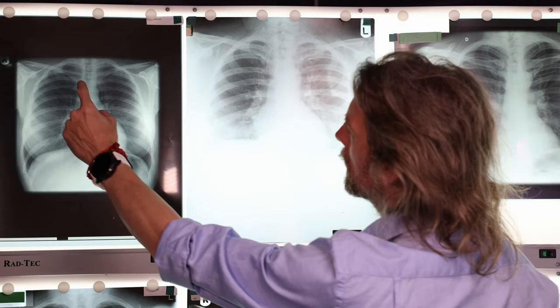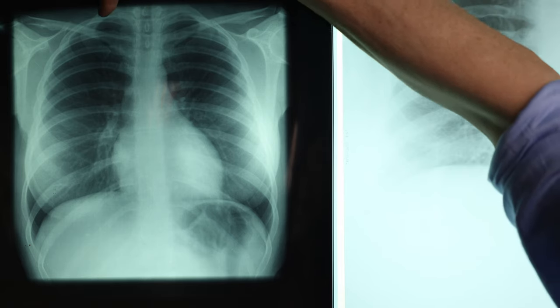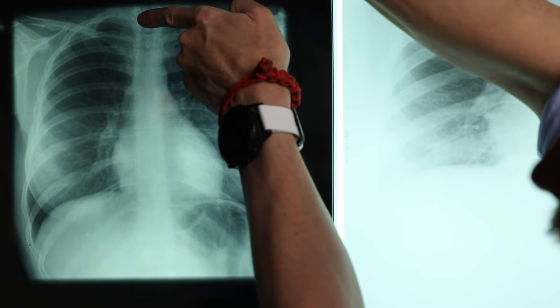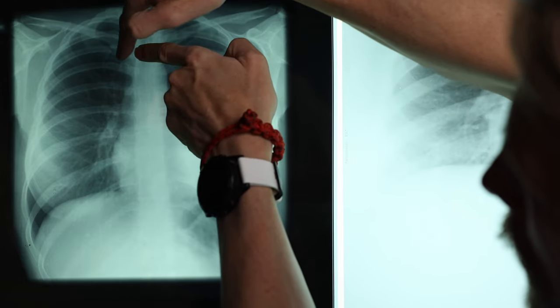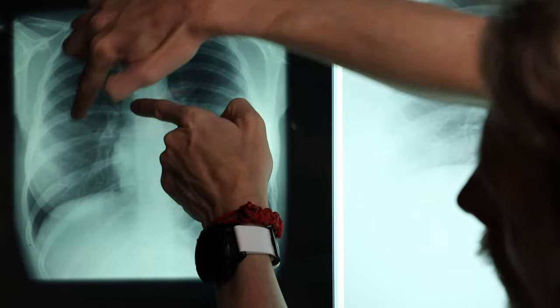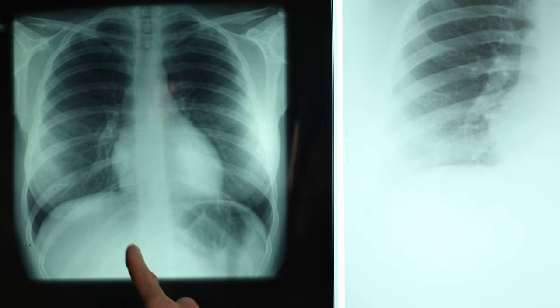Think about this one over here — can you see again that first rib is a distinct shape? Here are the vertebrae, nice and visible, and up high we can see this tight curve of the first rib. Note that the second rib is very nearby. So we start at the first rib and go: first rib, second rib, third rib, fourth rib, fifth rib, sixth, seventh, eighth, ninth, tenth, there's the eleventh — and we're losing 12, we see 12 over there.